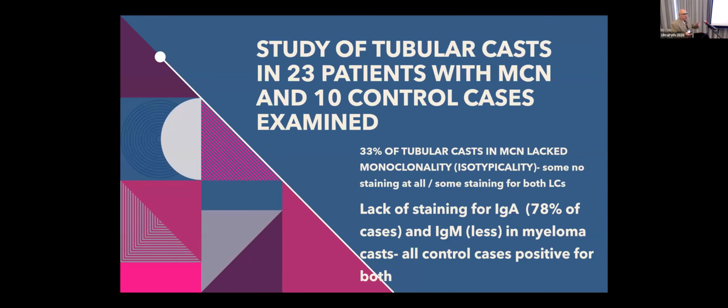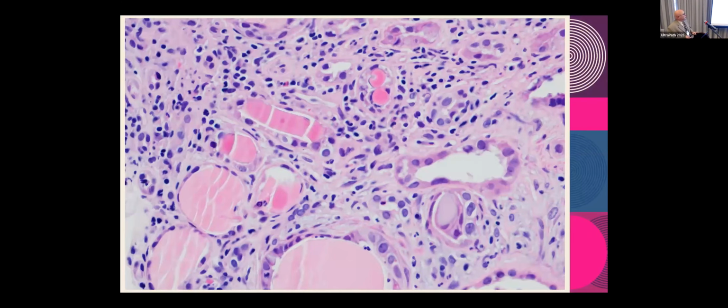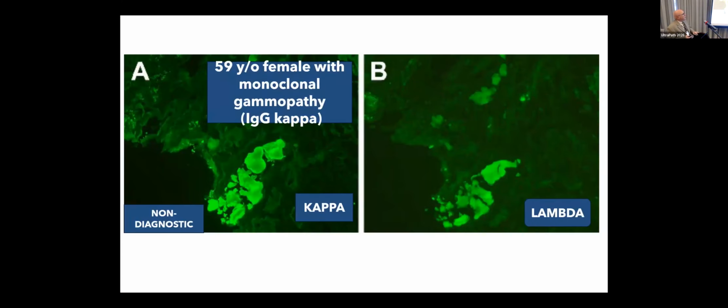And so we went ahead and studied those 23 cases. They were looked at by 4 nephropathologists, and they were very carefully examined ultrastructurally. Notice again the fracture planes, how beautiful they are. Notice again the inflammatory infiltrate. Notice that some of the casts contain inflammatory cells, all the features of myeloma cast nephropathy.